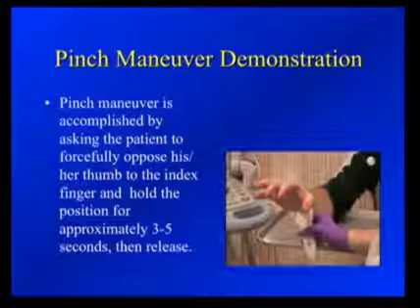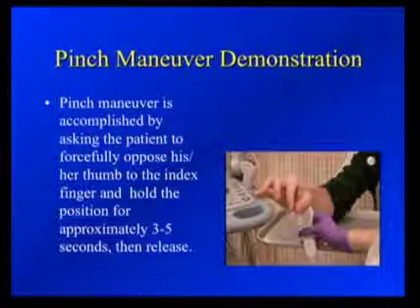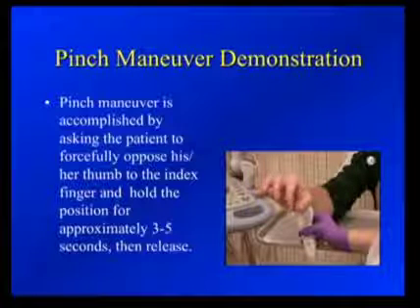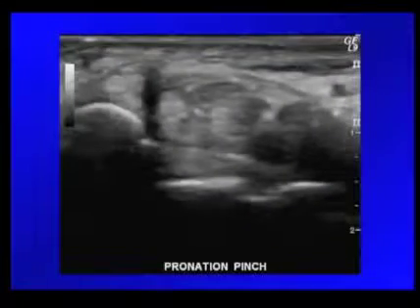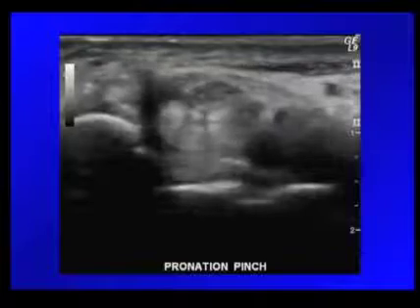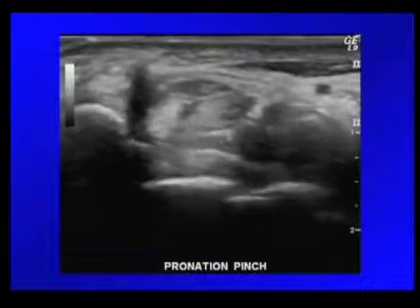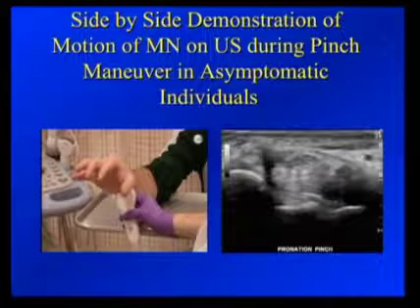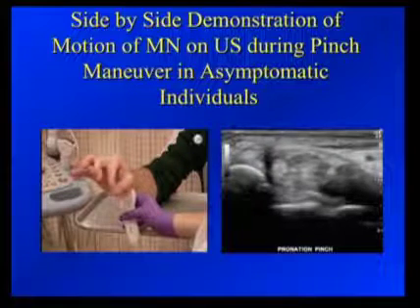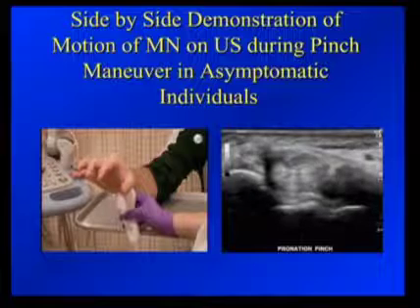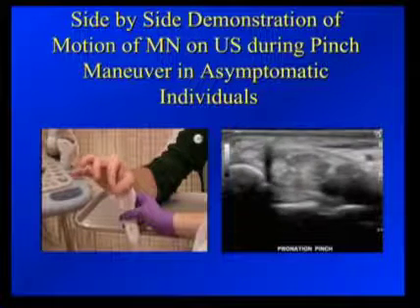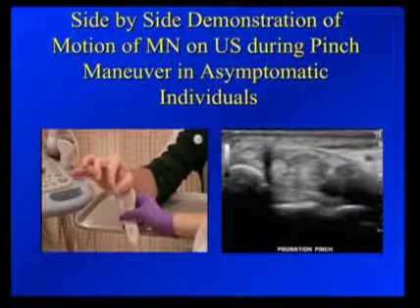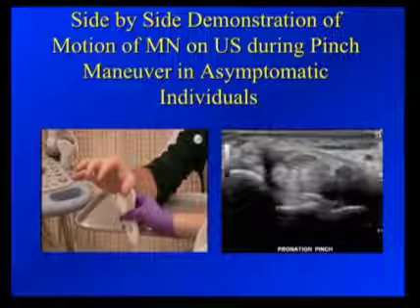Practically, we have the patient hold a fairly tight pinch for three to five seconds during visualization of the median nerve over the carpal tunnel. On ultrasound, you can observe some movement of the median nerve during pinching, but there is no entrapment within the carpal tunnel. A side-by-side comparison of the pinch maneuver in an asymptomatic individual shows that once pinching starts, there is some movement and some flattening of the median nerve, but the nerve is not entrapped — there is no sagittal movement with this maneuver.